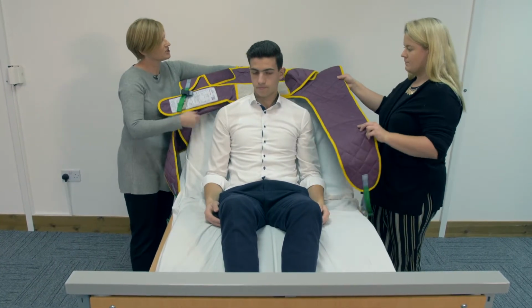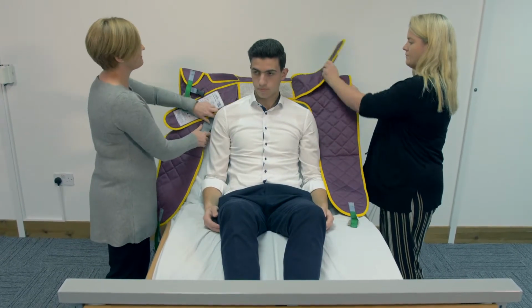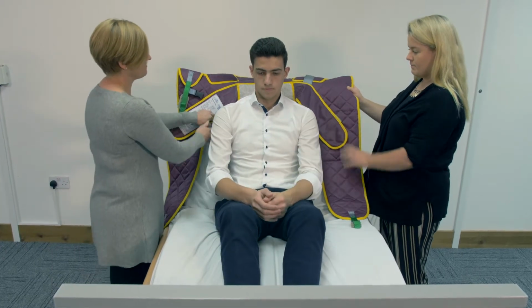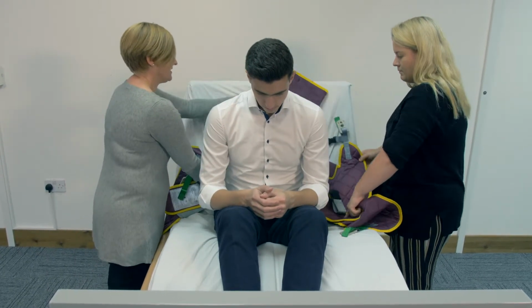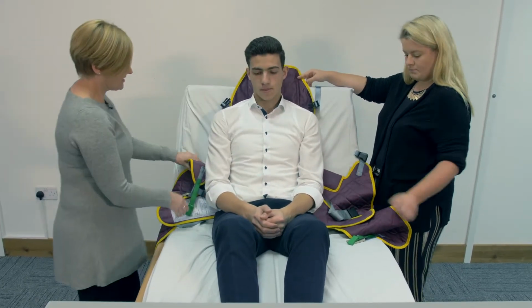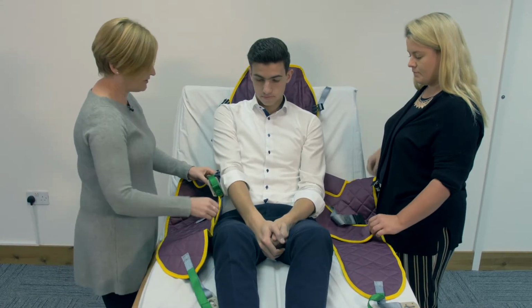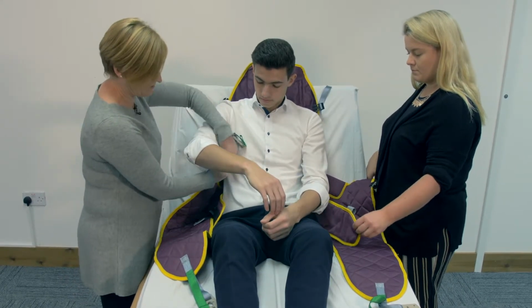I'm just going to pass the sling over the top end of the bed, and then we're going to get it into position around the shoulders so that we're ready for when the user can sit forward for us. So when you're ready, if you can sit forward, that's lovely, and then you can relax back onto the sling.